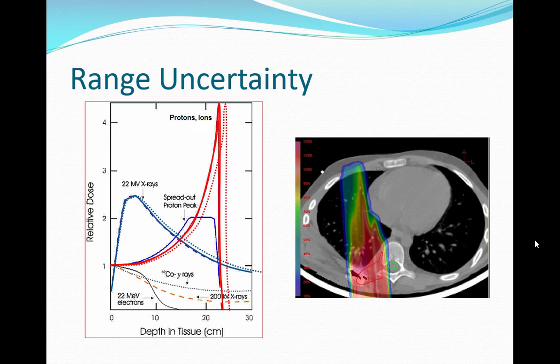If you wonder if this happens, the one on the right-hand side is lung tissue. So lungs are notorious for this, right? Your lungs, you go from muscle wall and bone, and then all of a sudden you've got this alveoli and air, right? So the uncertainty range becomes crazy as you go through. Here we're coming from the back, there's a tumor near the spinal column.